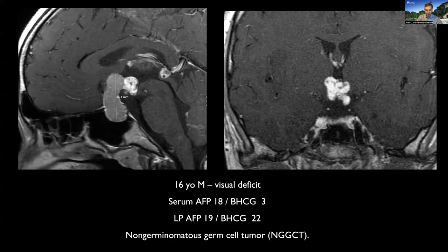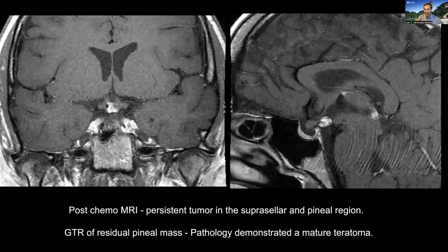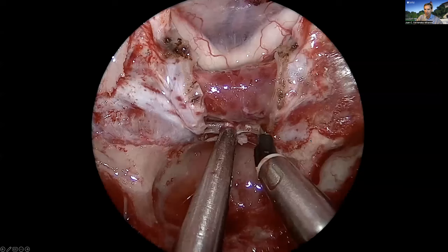It's not all about craniopharyngiomas — sometimes we have other tumors involving the hypothalamus. This 16-year-old presented with a combined sellar, suprasellar, and pineal region tumor, initially treated with chemotherapy with a relatively good response, but residual tumor persisted in the hypothalamus and a pineal mass proven as mature teratoma, so we decided to perform surgery. Note how narrow the space is between the optic apparatus and the pituitary gland — the dorsum sella is in my way to reach the hypothalamus. I decided to remove the pituitary gland entirely in this case because this patient has no pituitary function and there is no chance of recovery, requiring instead of pituitary transposition, a pituitary resection.